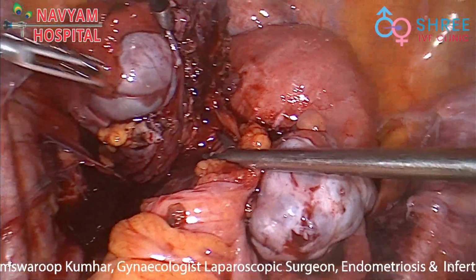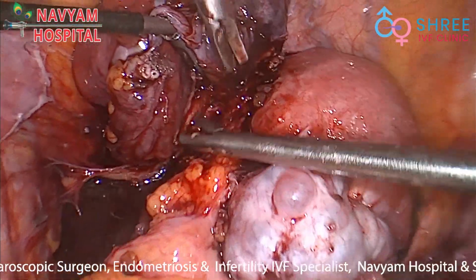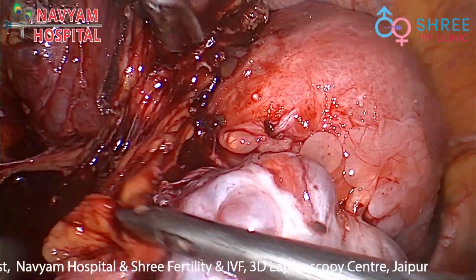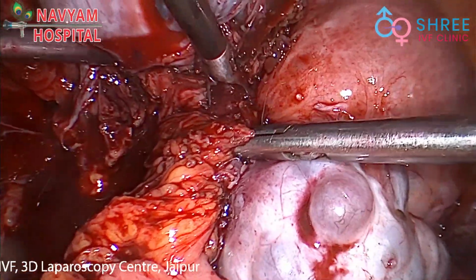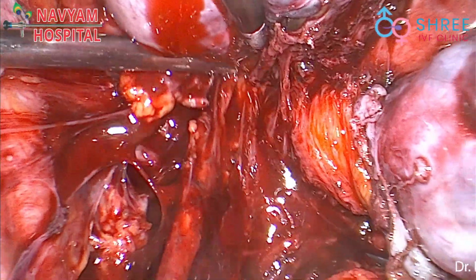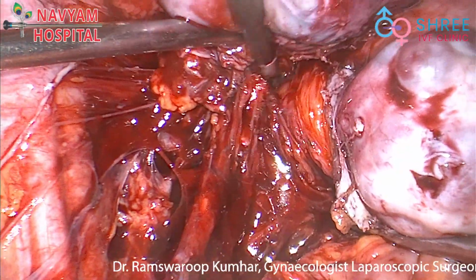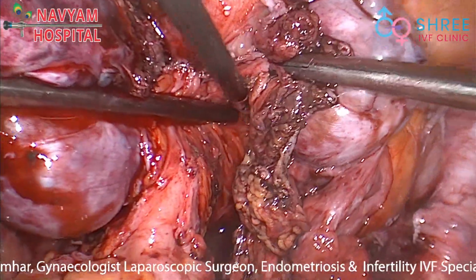Now the most important part of the surgery, the rectal dissection, remains, and we are trying to dissect it in a gentle manner. For the rectal dissection, we have to dissect it laterally first, then in the center. Fiber by fiber dissection and proper identification of the tissue planes is very important to dissect this rectum.